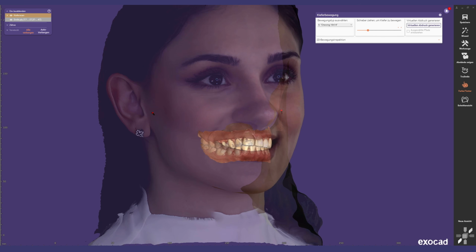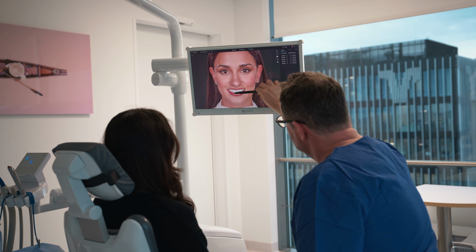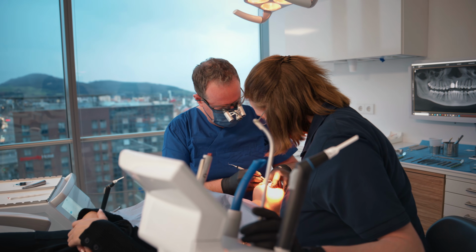After scrutinizing all the clinical and laboratory steps, it became clear that an ill-fitted face bow in the dental chair led to false assumptions in the lab, which then caused all the trouble. Thanks to working fully digital these days, such bad experiences now belong to the past. I completely changed my approach and have better tools available. Now I strictly follow these 5 key principles: creating the design of a future restoration, formulating a comprehensive treatment plan, presenting the plan to the patient, performing the treatment accurately and effectively, and finally promoting the results.